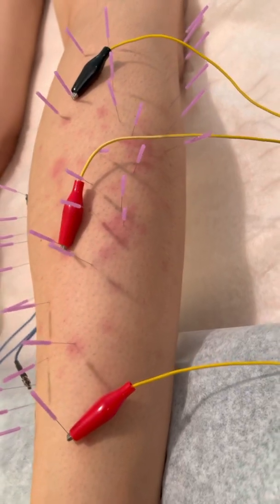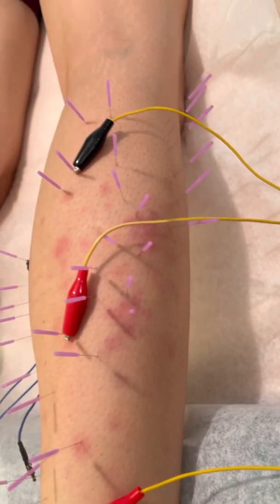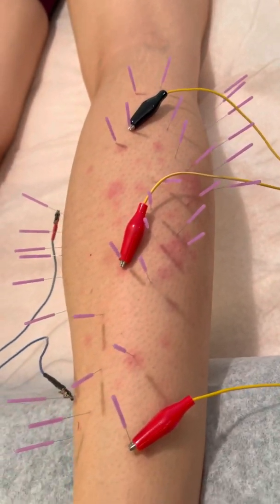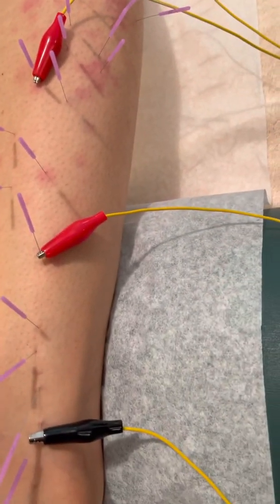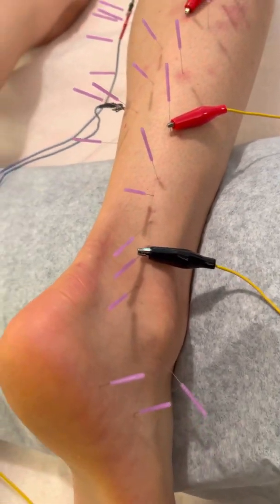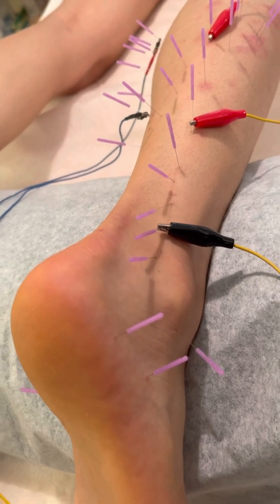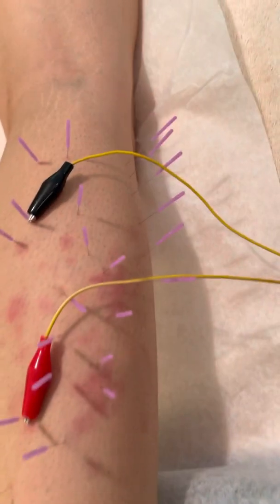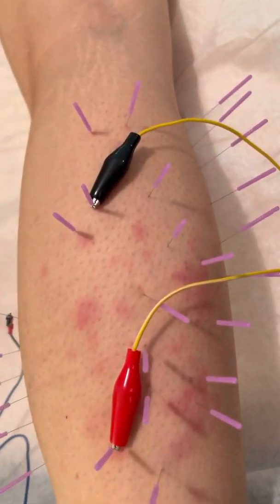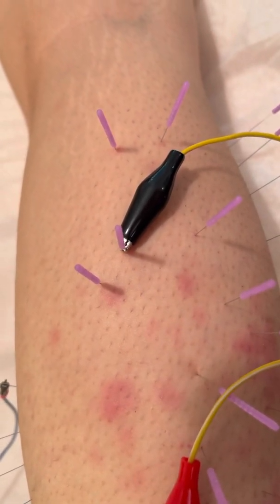And in her case, it involves the peroneus longus and the peroneus brevis, as well as the soleus, and then also fascia and ligaments going all the way down into her foot where I've needled the plantar fascia. So actually, let me show you the needles from the top first. And then what I wanted to show you is I'm doing electrical stimulation, and that's what electro stim looks like.